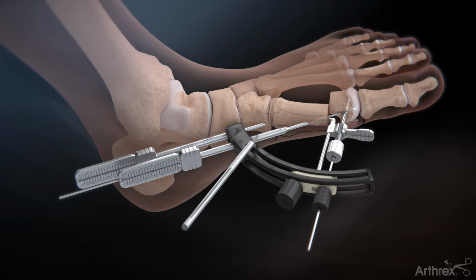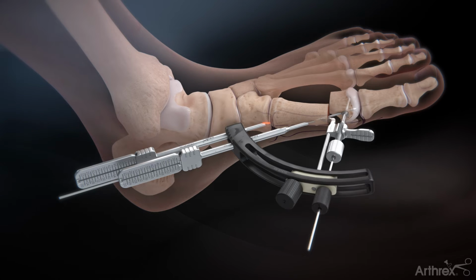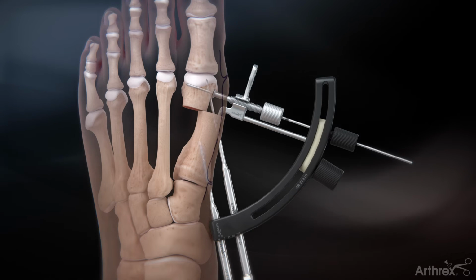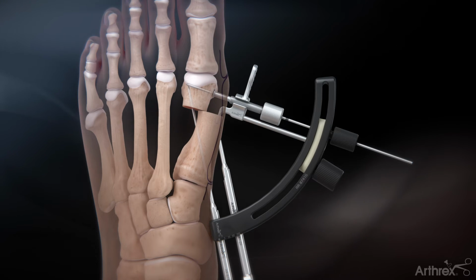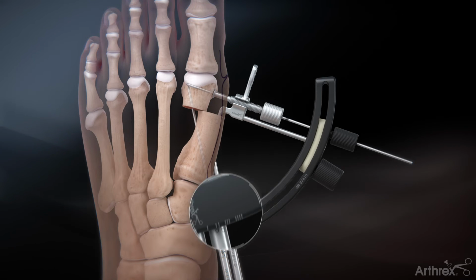Make a stab incision at the site where the proximal K-wire sleeve contacts the skin. Slide the sleeve down to bone, ensuring that the bevel of the sleeve parallels the metatarsal. Advance a K-wire through this sleeve, traversing both cortices before entering the capital fragment. Remove the temporary guide wire and shift the second K-wire sleeve distal to the first, being sure to skip at least one slot.